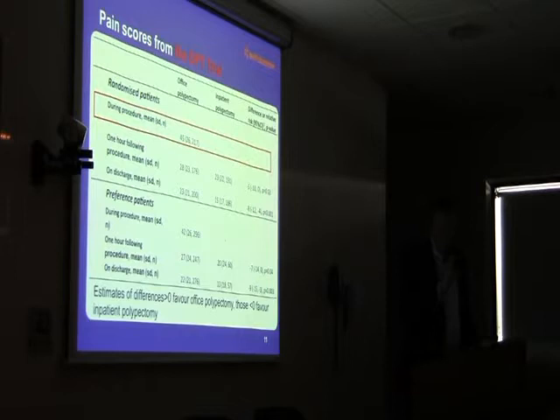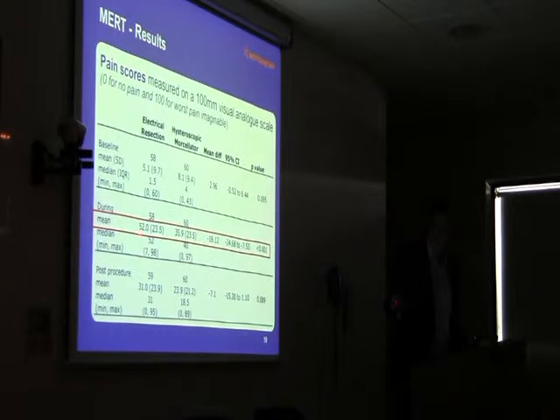Diagnostic hysteroscopy would be 2, probably. So that's 4.5, and as you can see, the previous slide I showed you from the TRUE CLEAR study, we were getting 52. We didn't really do any morcellators in the OPT trial because it wasn't available to us then. But now you can see this seems to be not only quicker, but associated with less pain.